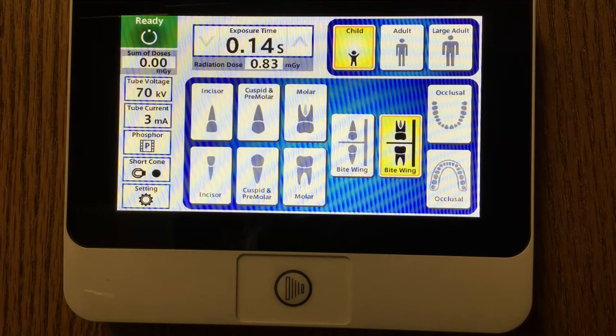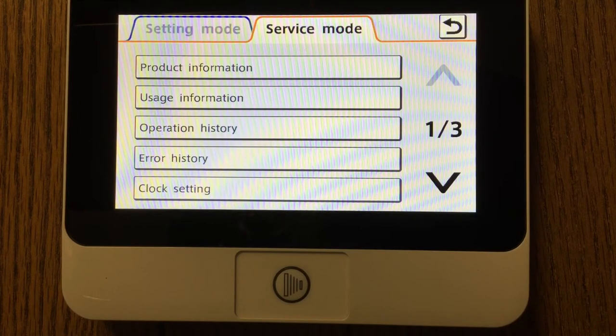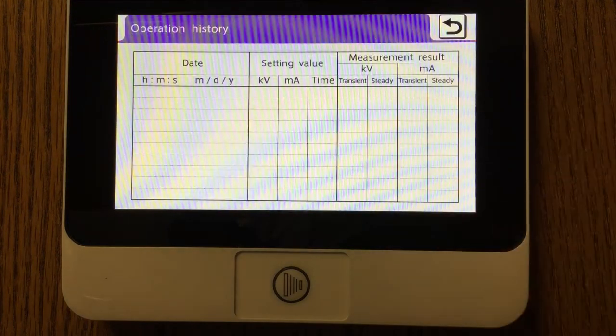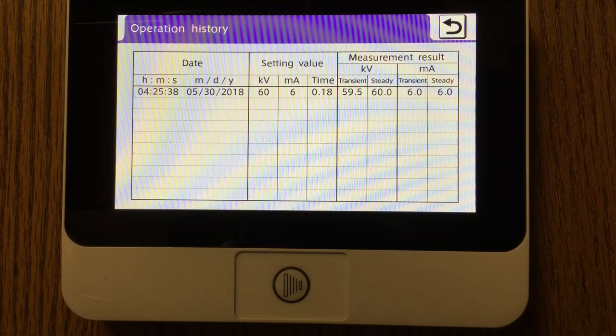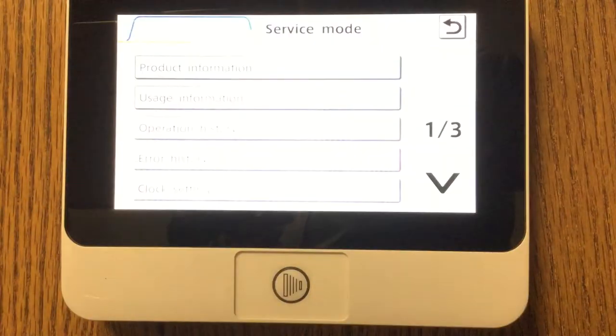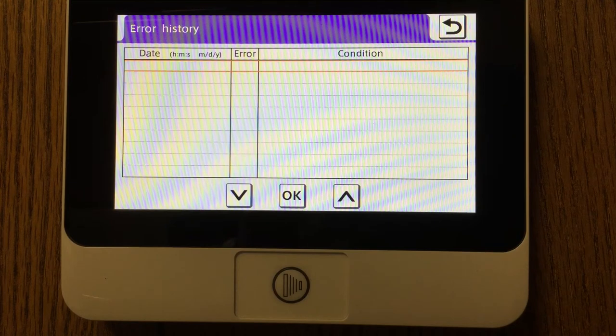The x-ray is in the ready position, so then I simply depress the exposure button and the dosage is delivered. Upon entering the service mode, there'll be a wide variety of information available to the doctor, the sales rep, or the service technician. I will be able to come in and review the total number of images that have been taken with the unit. I could look at the entire operation of the unit, which will tell me the day and time as well as the kV and MA settings for each of the individual x-rays taken. I'll also be able to see how many errors have occurred along with the type of error that occurred during the exposure.